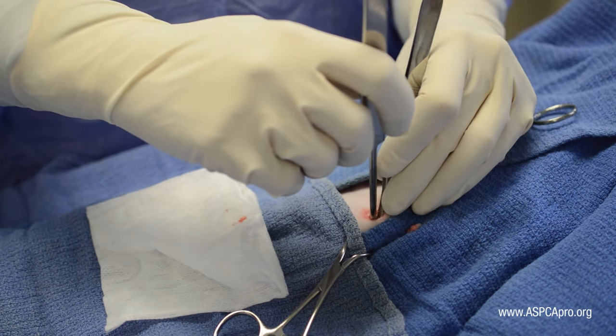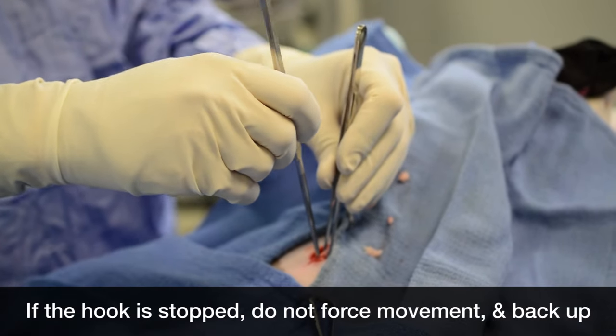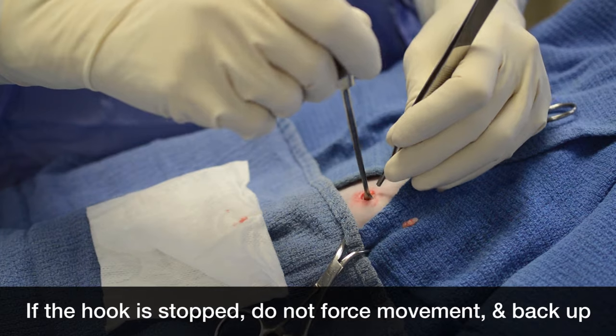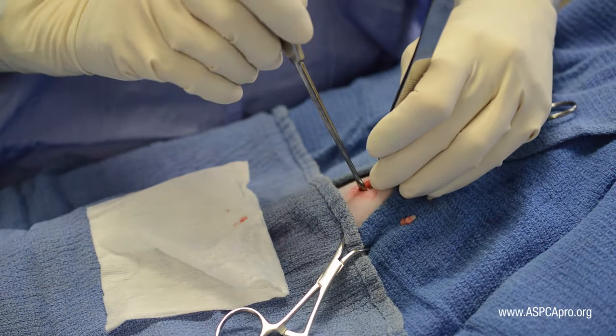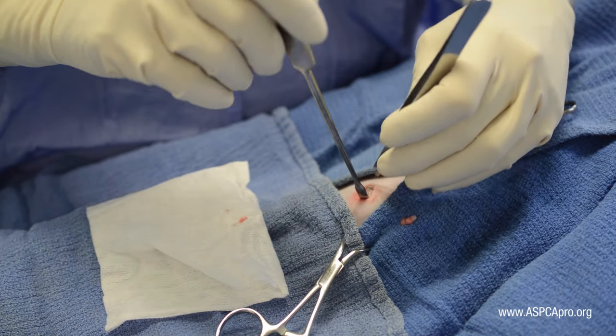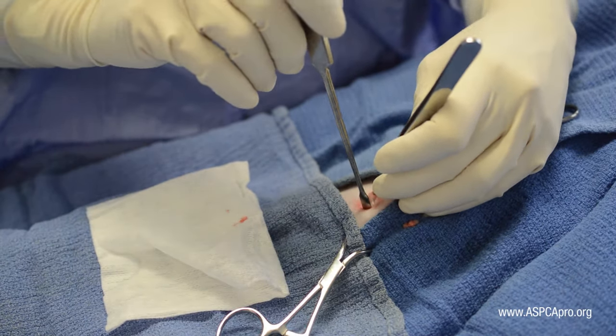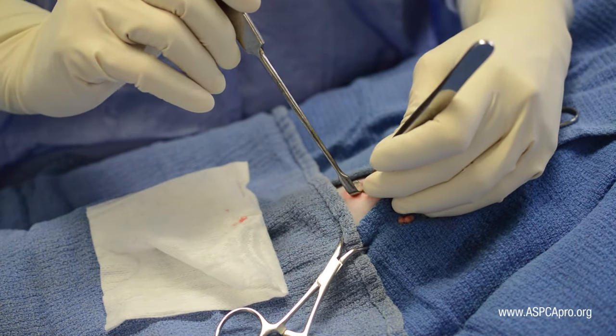When midline is reached, slowly begin to bring the hook towards the incision using a gentle rocking or pivoting motion to release any intestinal tract that may be caught in the hook. Continue upward traction on the body wall with thumb forceps. When the hook is visualized, gently remove the retrieved tissue layer by layer by picking it up and over the spay hook.